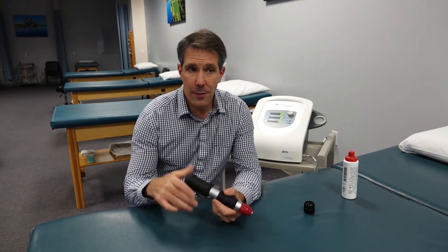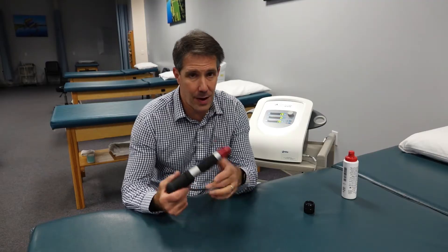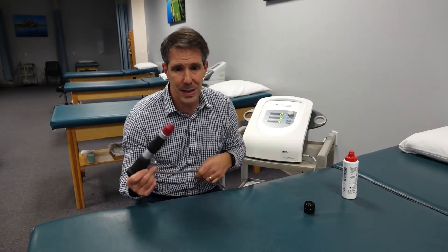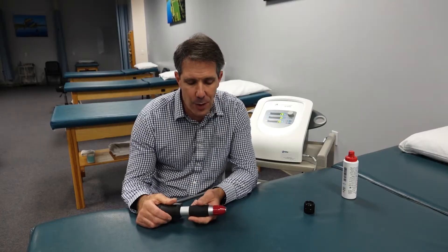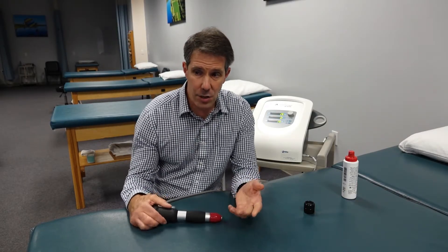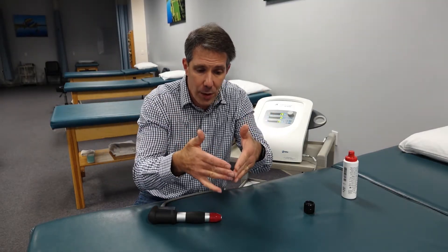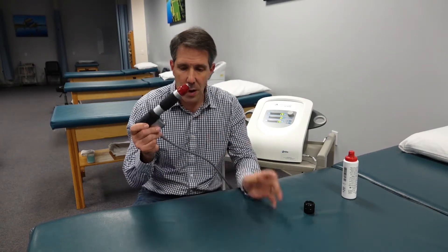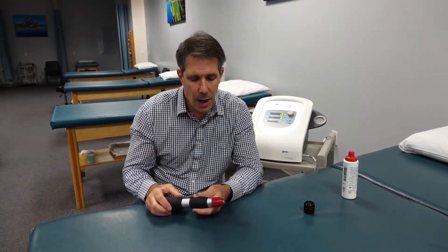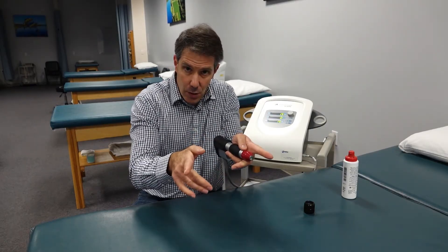Some of us are familiar with breaking kidney stones with lithotripsy — this is basically where this technology has been derived from. The difference is that when you use a device for breaking up kidney stones, the sound wave starts wide and goes into a point, hits the target and breaks it up. Whereas with the RPW we're going to be using, it starts at the head and widens as it goes out.